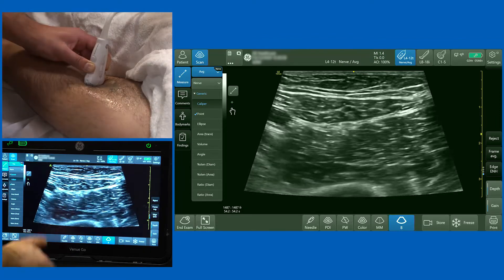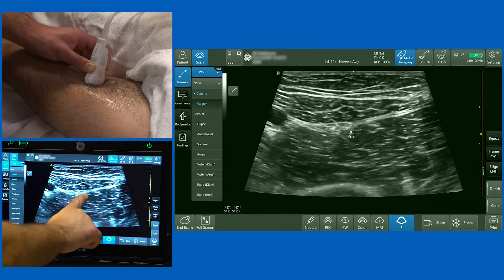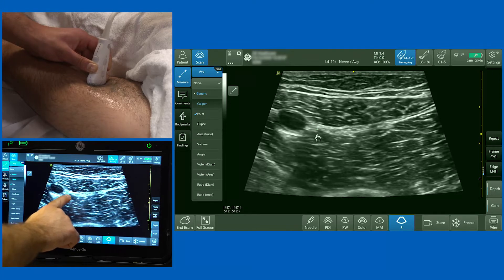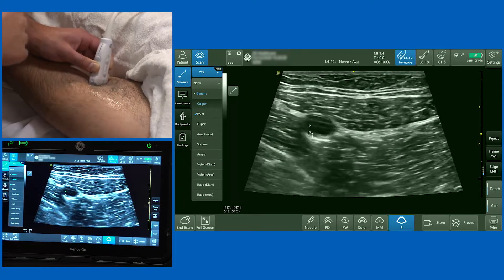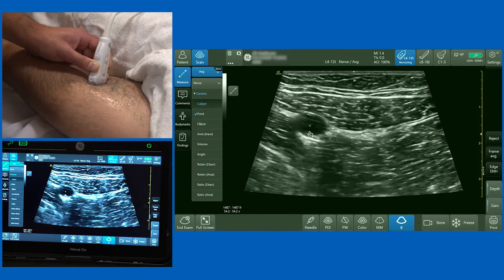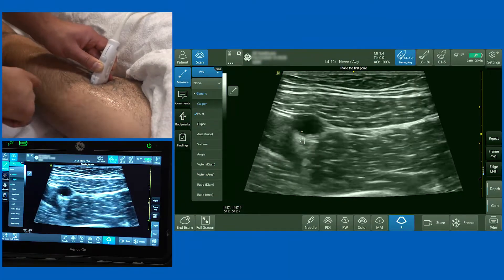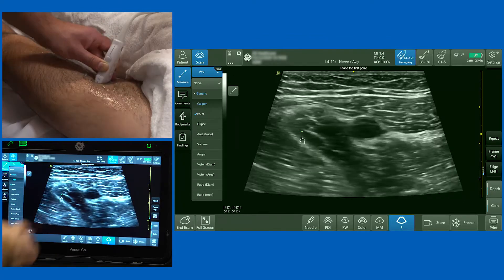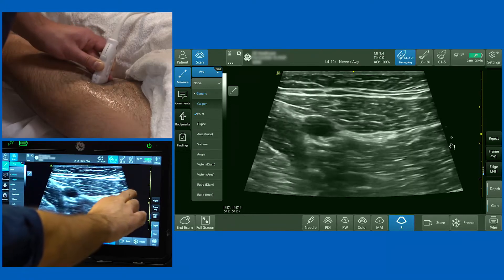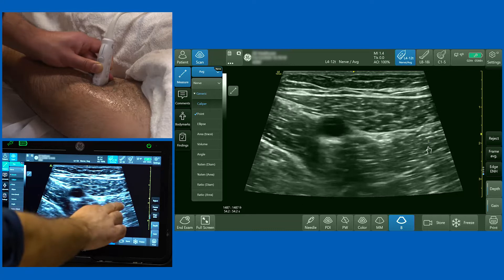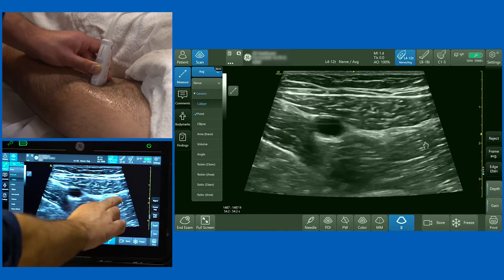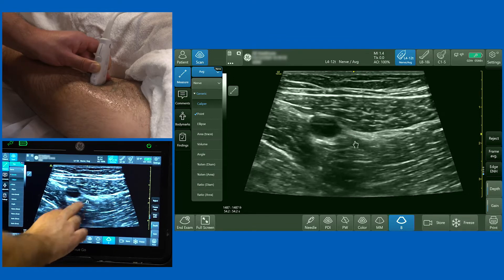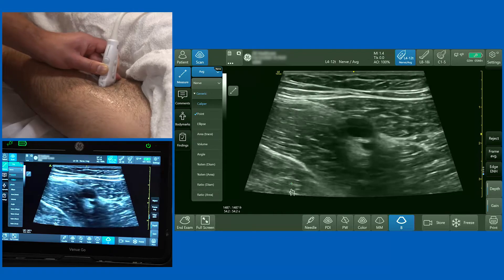If you bring your needle in here you will identify the nerve to vastus medialis and also get the rest of the contents of the adductor canal, which include the saphenous nerve as well as nerves in the subsartorial plexus. In summary: place the probe in the middle of the thigh at the point where the medial border of sartorius meets the medial border of adductor longus, then inject your local anaesthetic through the groove between sartorius and vastus medialis, aiming to open up this space and reach the lateral structures sitting within that tunnel — the saphenous nerve and the nerve to vastus medialis.